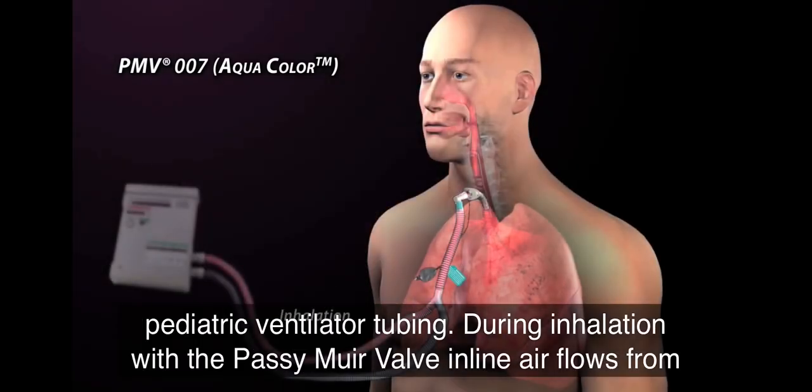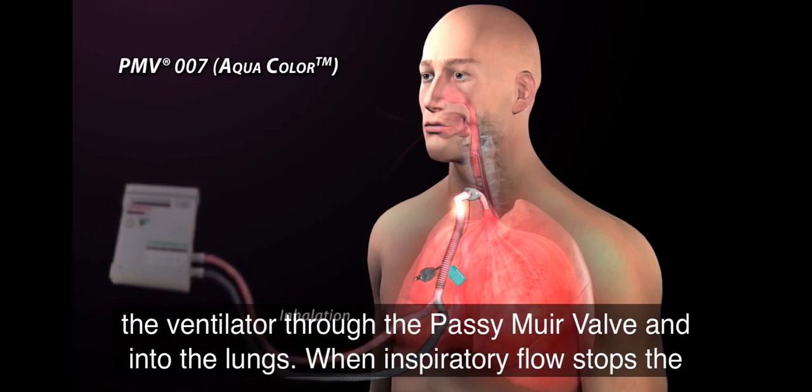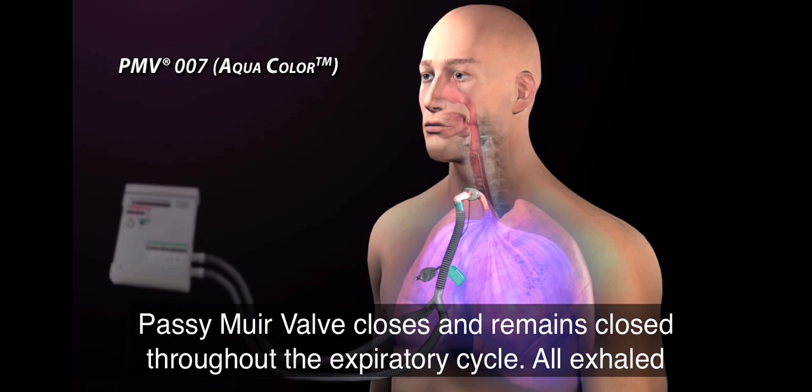During inhalation with the Passy Muir valve inline, air flows from the ventilator through the Passy Muir valve and into the lungs. When inspiratory flow stops, the Passy Muir valve closes and remains closed throughout the expiratory cycle.